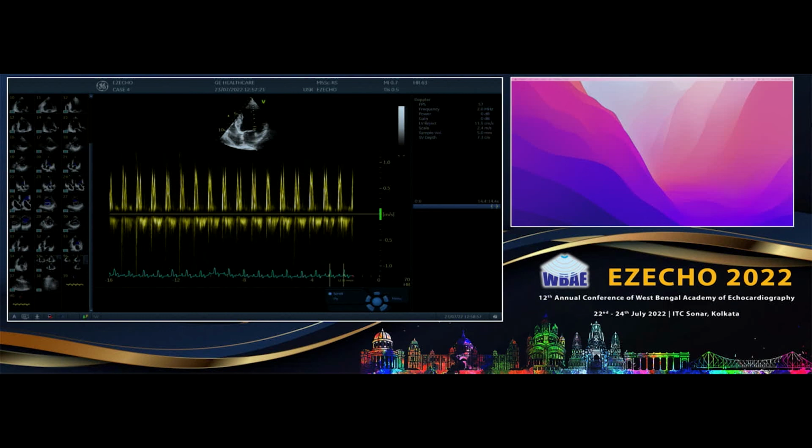So some of the segments continue to relax in the early part of the diastole, and some of them have already finished their relaxation. So there is always a diastolic dyssynchrony along with systolic dyssynchrony in LBBB. That means they always have diastolic dysfunction. Then again comes the question of whether they have high filling pressure or not. So here again the LA volumes will help you, E by E prime will help you. Isovolumic relaxation time will always be prolonged because there is slow relaxation. Always. So IVRT will not be useful.